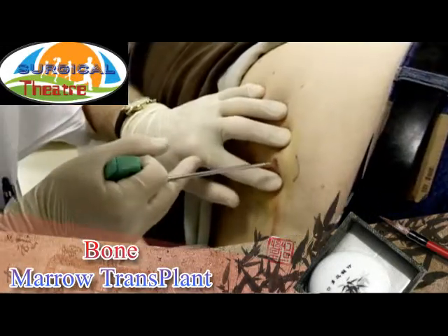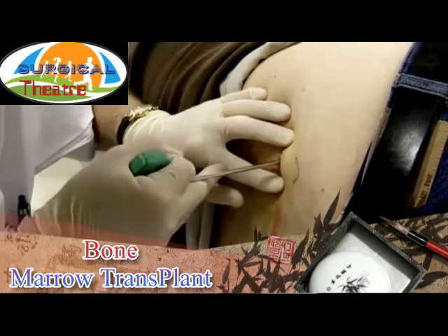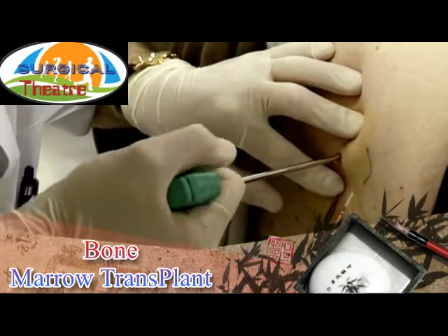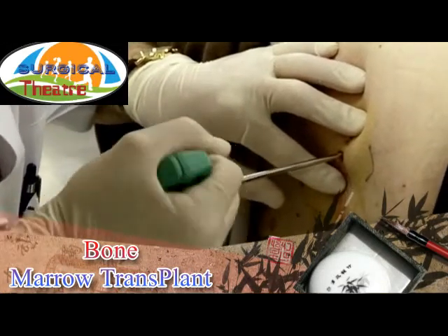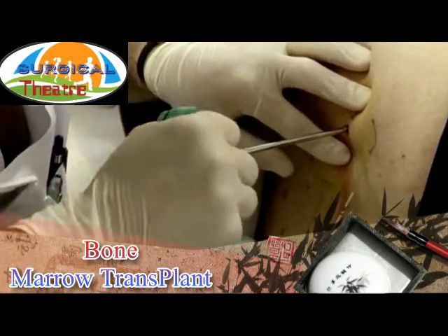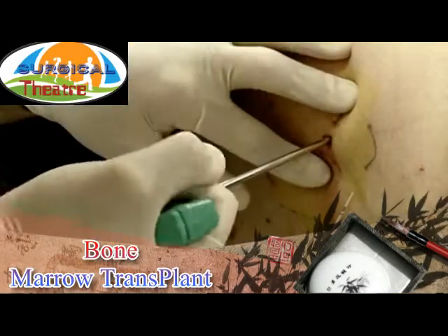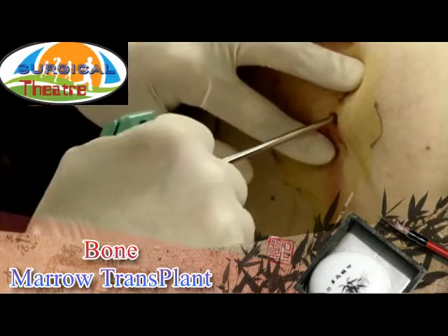Finally, a punch biopsy is taken using a disposable needle. The needle is inserted in the same puncture wound and pushed toward the posterior crest. The needle is rotated with constant pressure until it penetrates the iliac crest. Care is taken to ensure that the needle does not slide into an area that is not anesthetized.